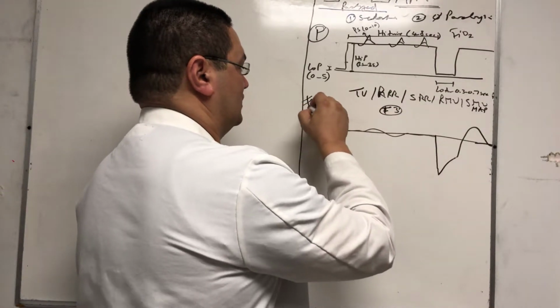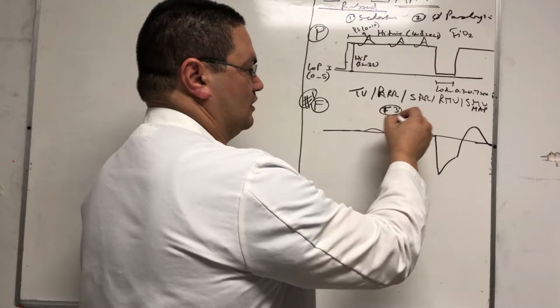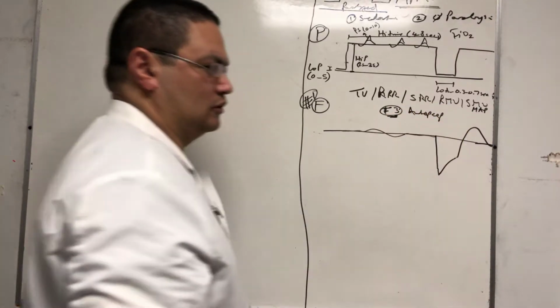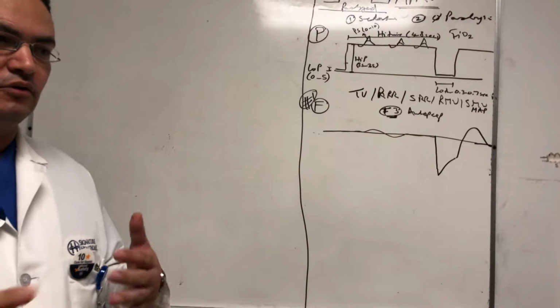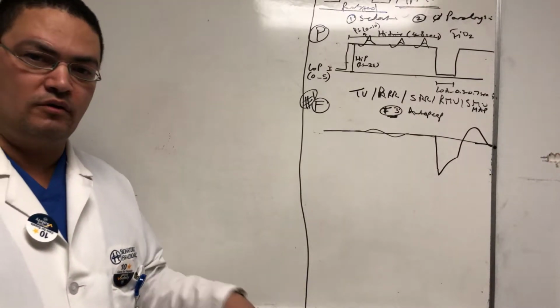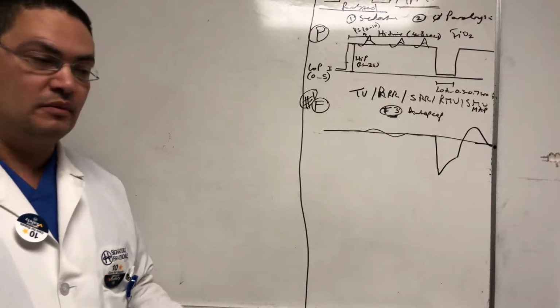And this is the first thing, the most important thing that we need to learn. But another claim to fame here is the auto-PEEP. It actually changed our understanding of auto-PEEP. When we typically see auto-PEEP, we say, no, we have to get rid of it. This mode of ventilation uses auto-PEEP to our advantage and the patient's advantage, intentionally using the auto-PEEP.